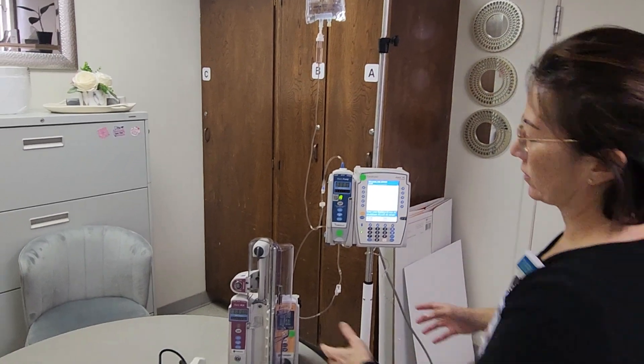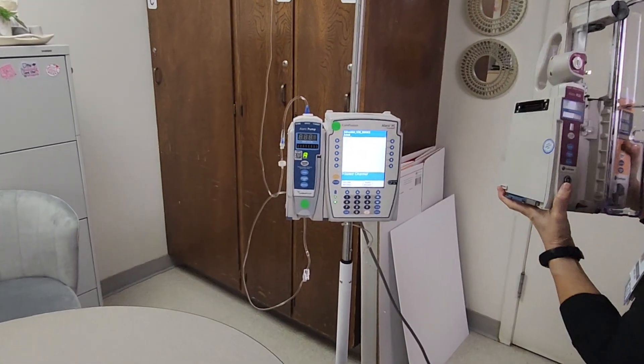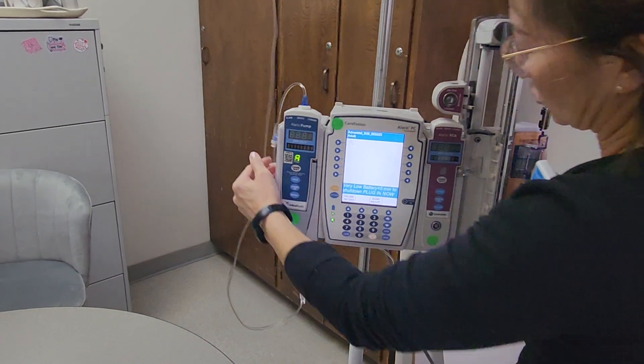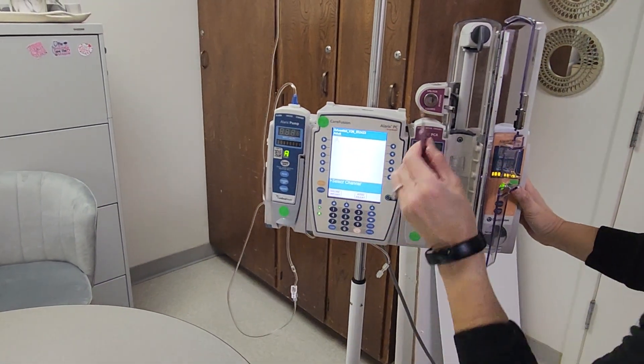Get your PCA channel and fit that onto your IV pump — you should hear it click. Make sure it's secure. You're going to need your PCA key.